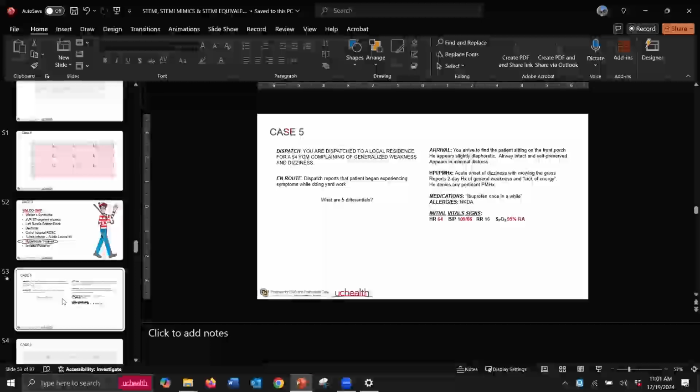Case 5. Dispatch. You are dispatched to a local residence for a 54-year-old male complaining of generalized weakness and dizziness. Dispatch reports the patient began experiencing symptoms while doing yard work. What are your 5 differentials?